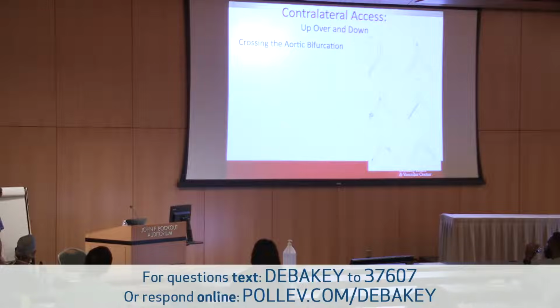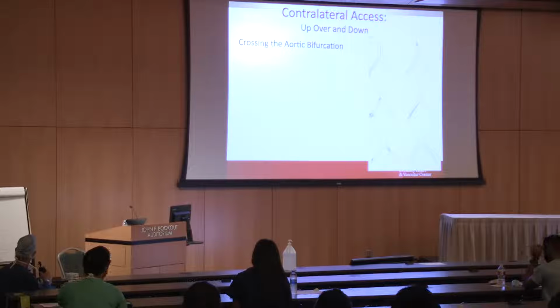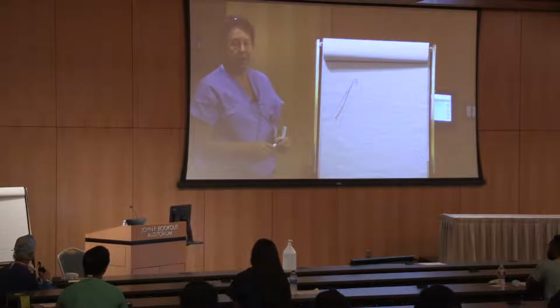So what happens is that you've got to reform the catheter. Unlike the Simmons catheter, which I showed you, the thing is that long, so it reforms. It's too big for the diameter of the aorta, so that when you pull the wire out, it kind of goes like that, and it does not reform into a shepherd's crook type pattern.